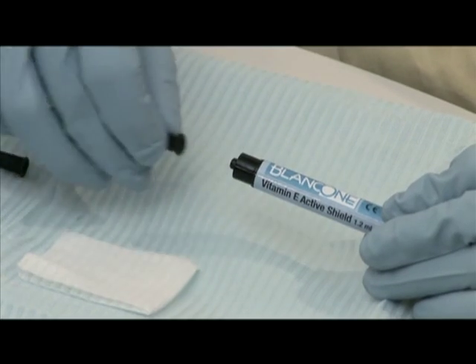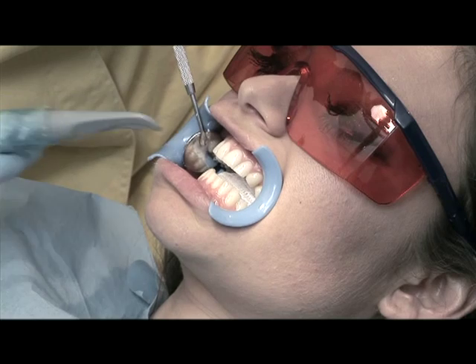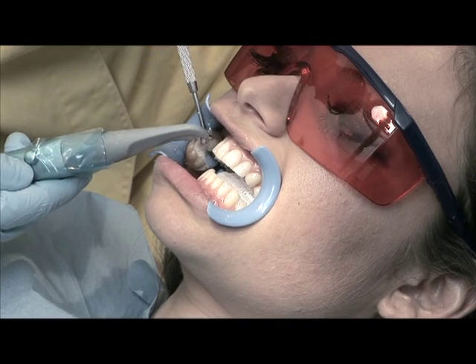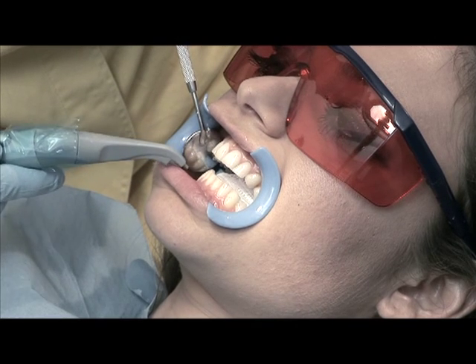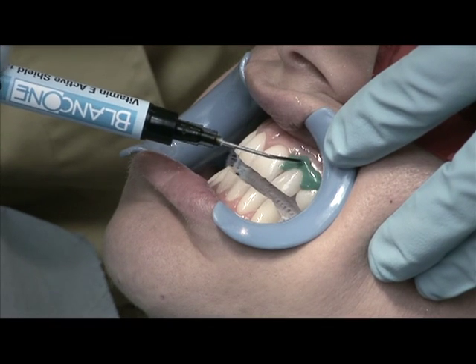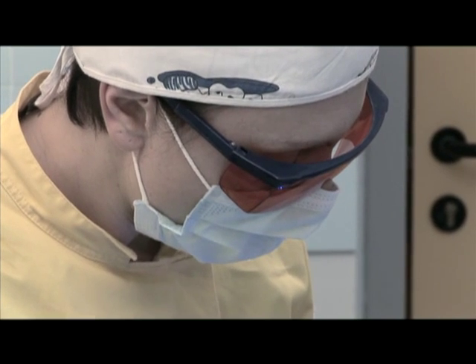Put the black tip on the syringe containing the Blanc 1 vitamin E active shield, which will be applied to protect the gum tissue. To correctly position the photopolymerizing liquid dam, first use air to dry the surface of the soft tissues. Put the protective gel on two or three teeth at a time and then continue with the photopolymerization. Repeat this on all the teeth to be whitened.